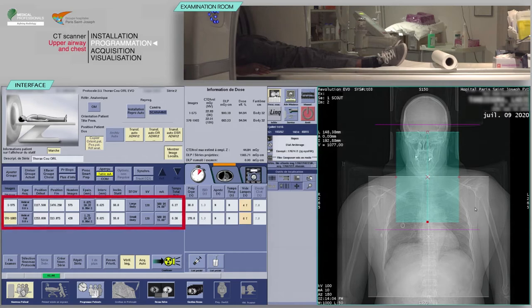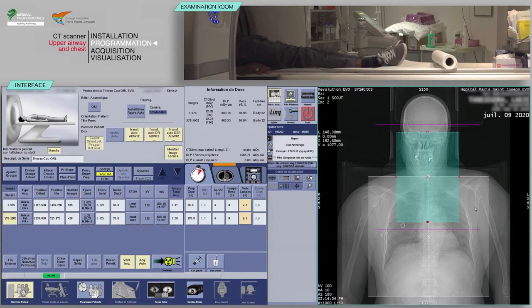Verify the consistency of acquisition parameters, which are often pre-configured. Before continuing, check that the predicted dose is consistent with the diagnostic guideline values.